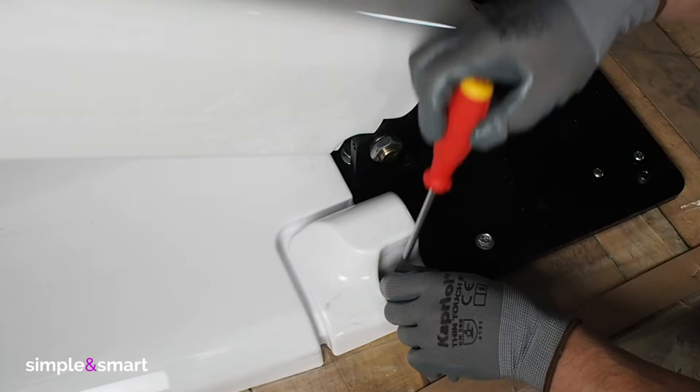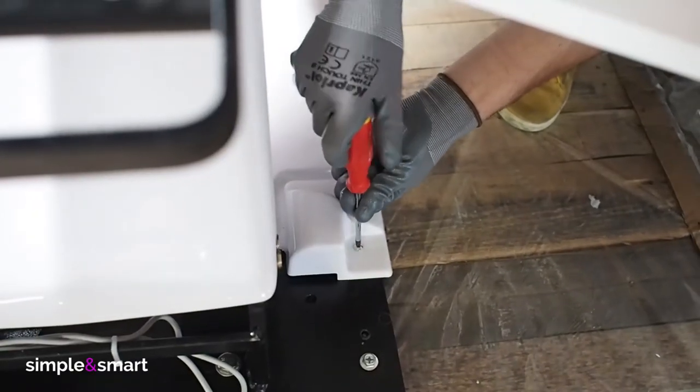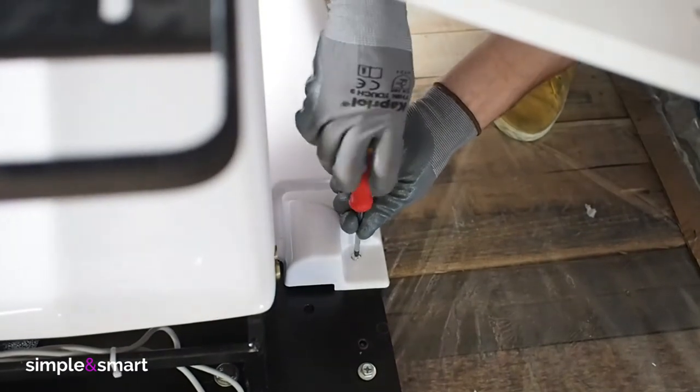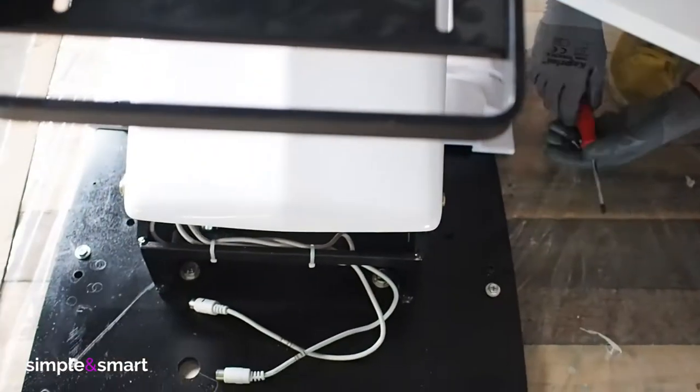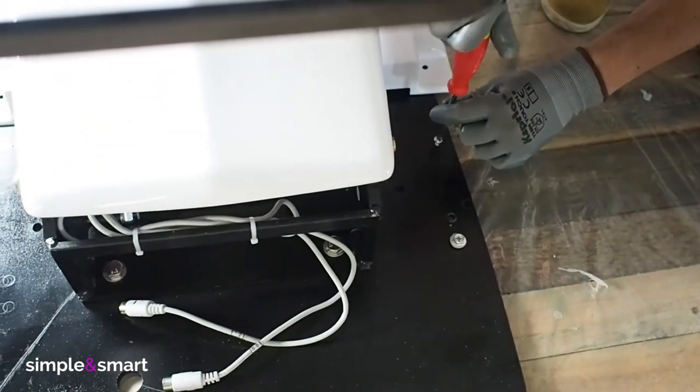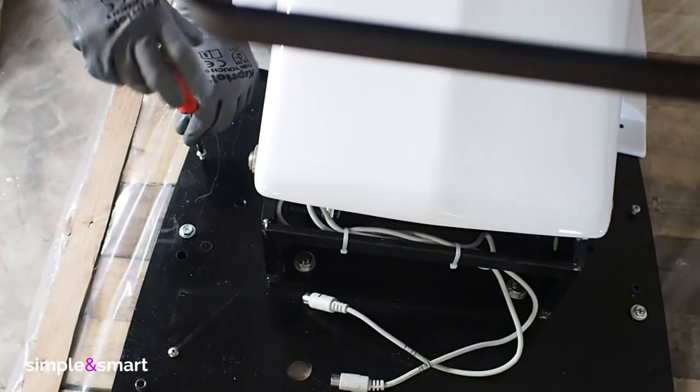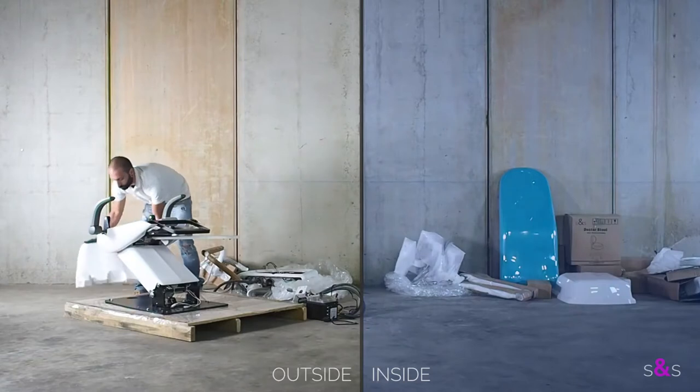Take out the two screws that keep the back plastic cover of the chair. Remove the cover and place the back of the screws on a metal surface. Bring the cover inside the clinic.